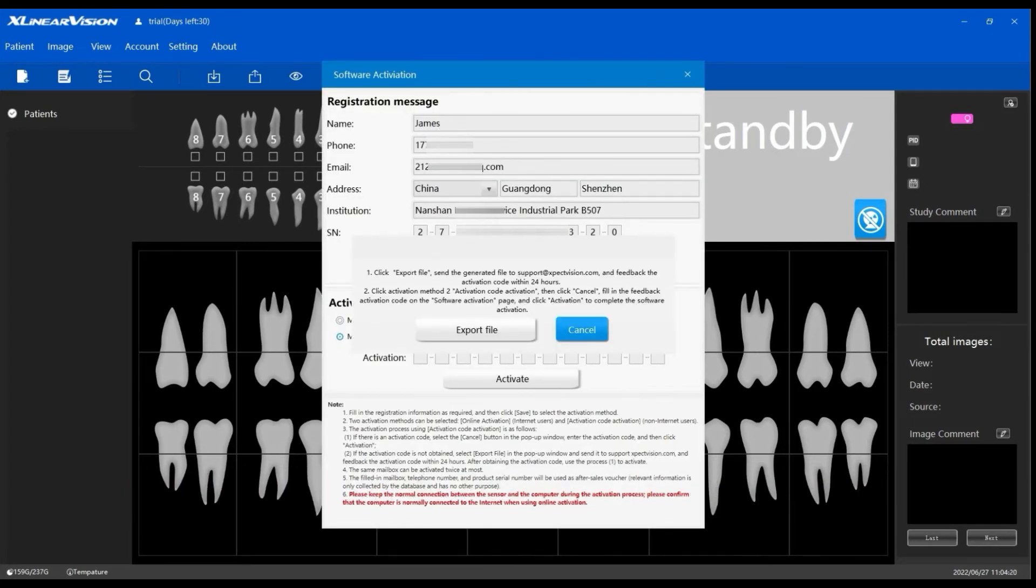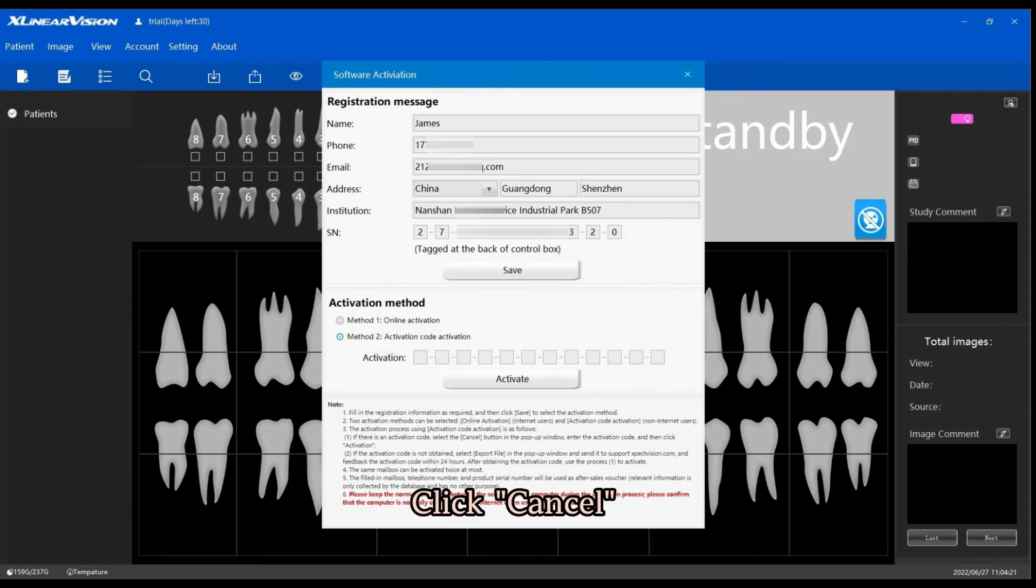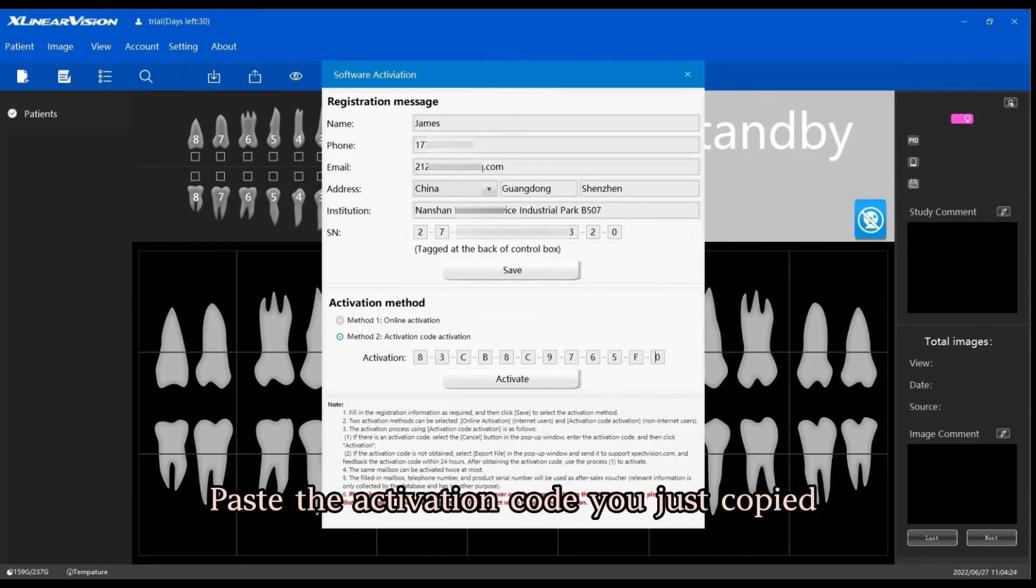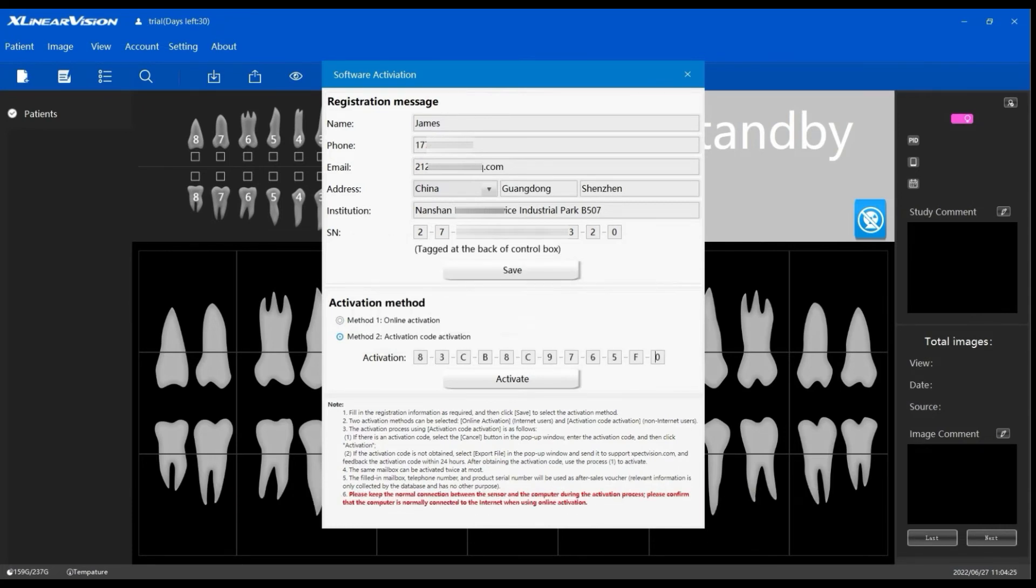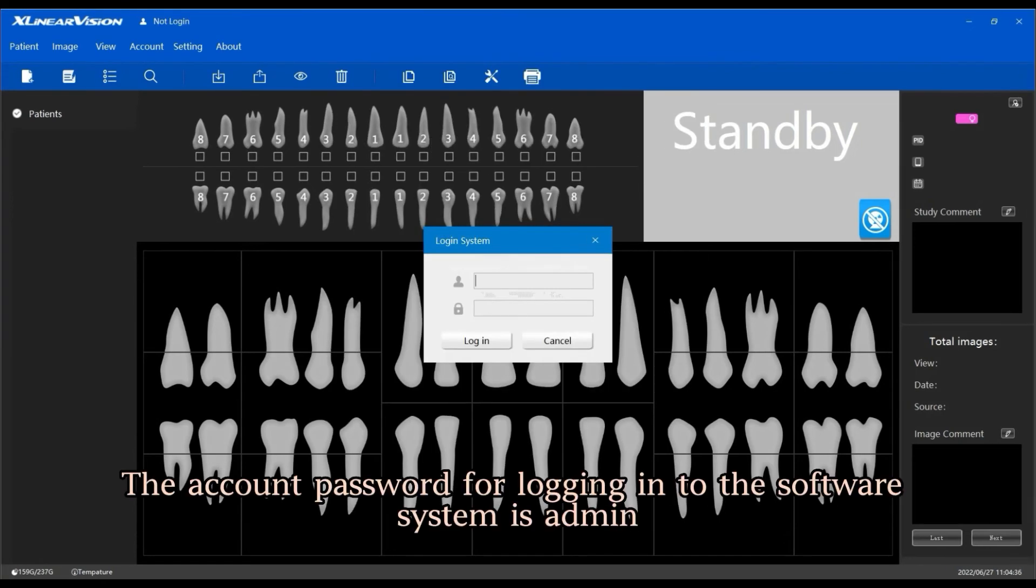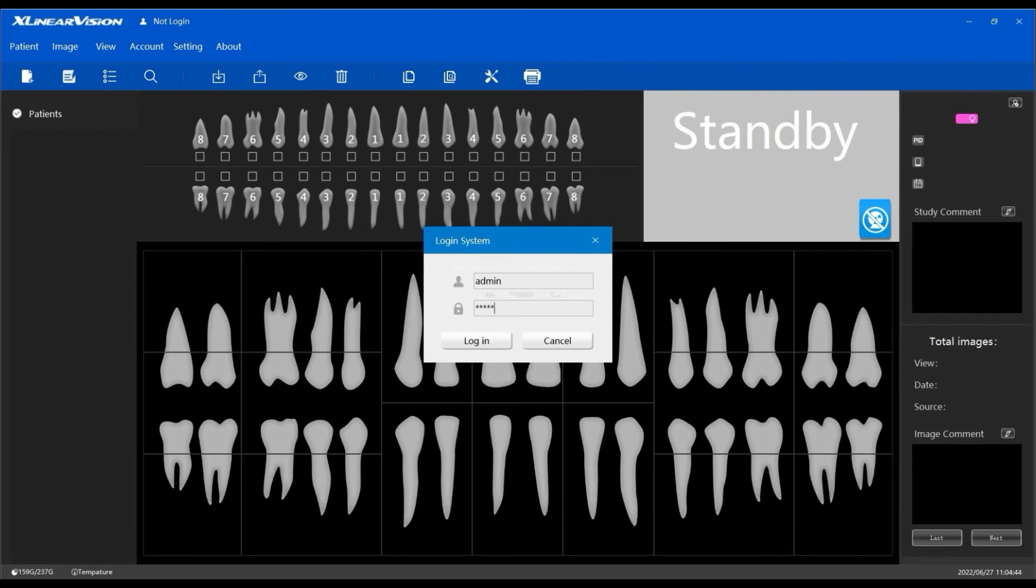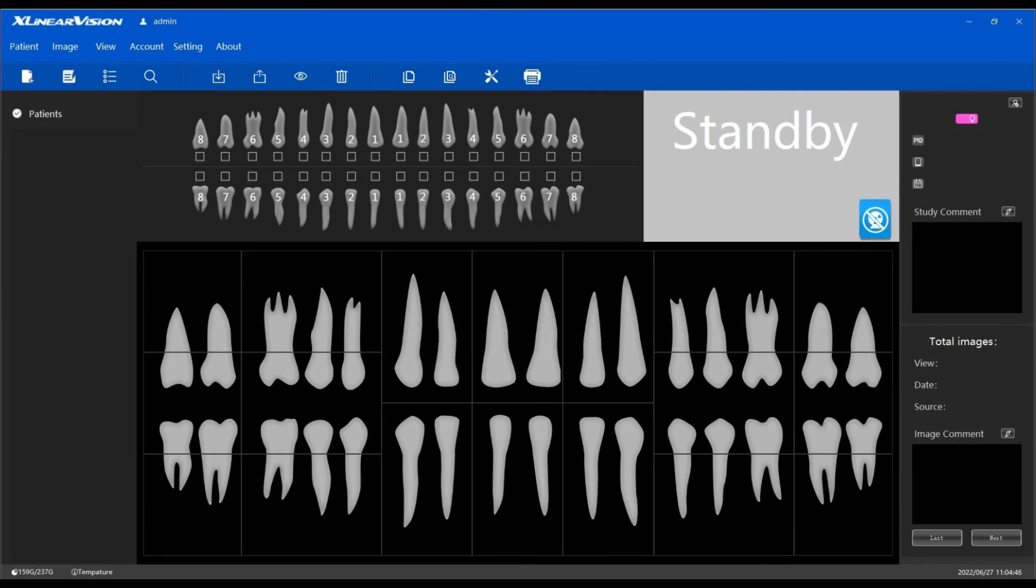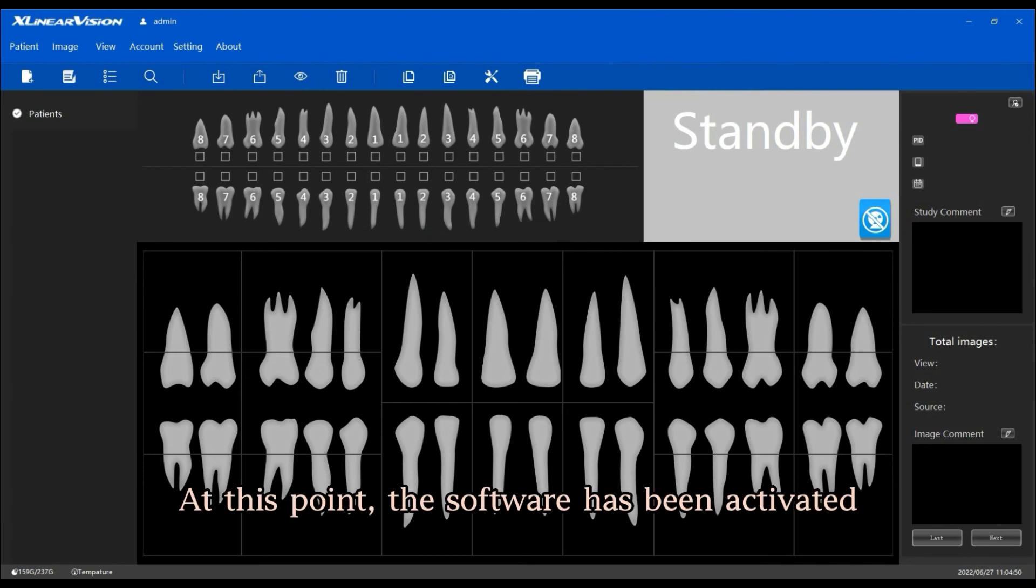Click Cancel, then paste the activation code you just copied. Click Activate, then OK. The account password for logging into the software system is admin. Click Login. At this point, the software has been activated.